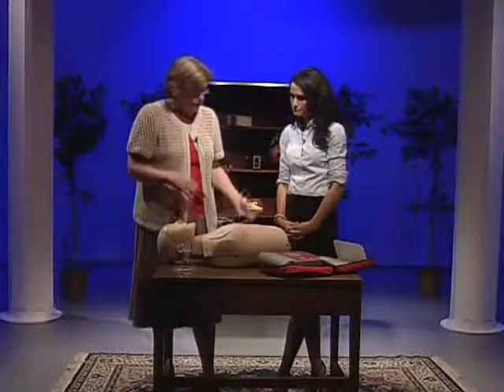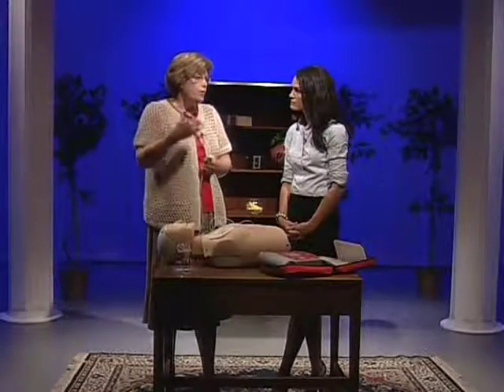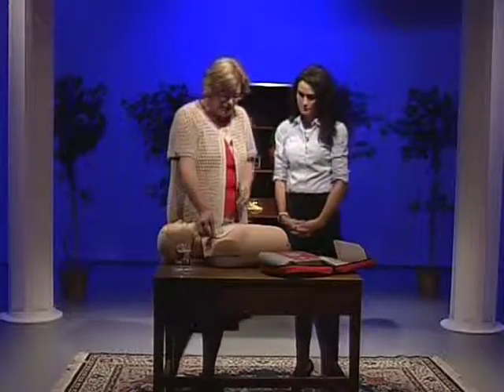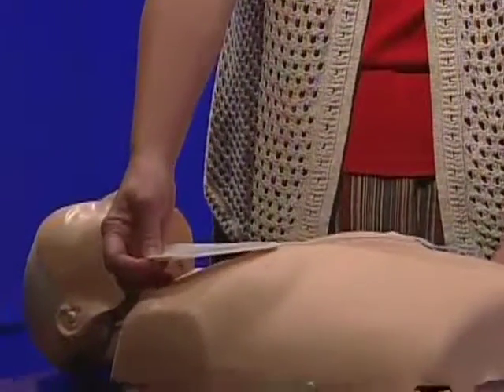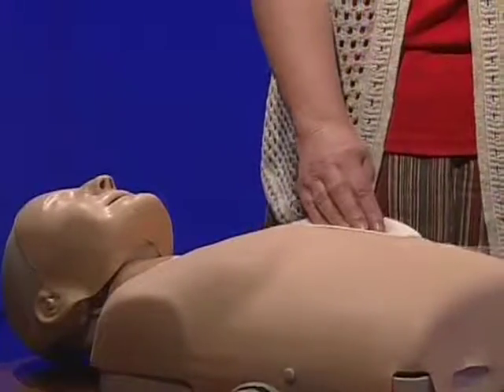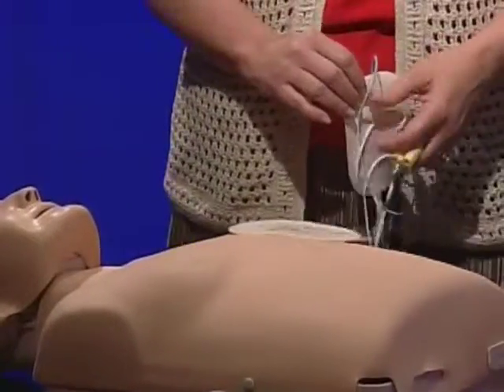Right. However, the American Heart Association in their guidelines say if you don't have that pediatric set of pads and your child has collapsed, it's better to use the adult size and the adult dose than none at all. Right. The placement of the pads may have to be a little bit different. If I've got a 3 or 4 year old child, certainly these may not fit on the chest. So what we would do is actually put them on the front and on the back, so that the electricity is going through the heart. And that's our goal.